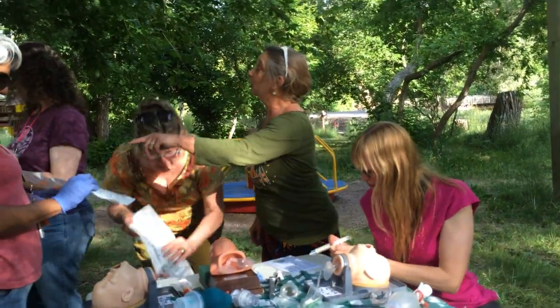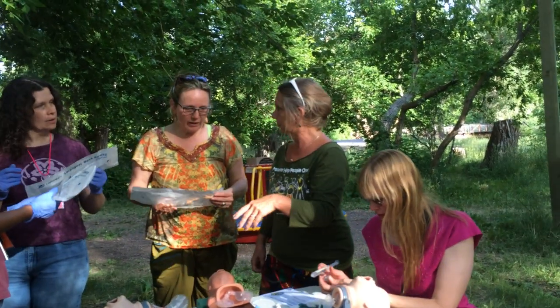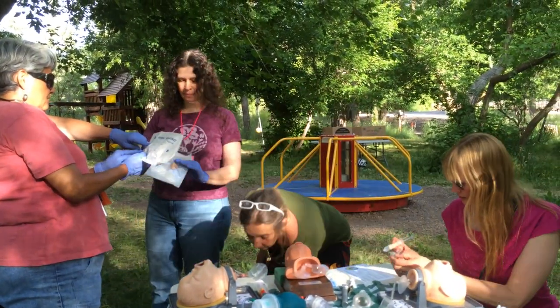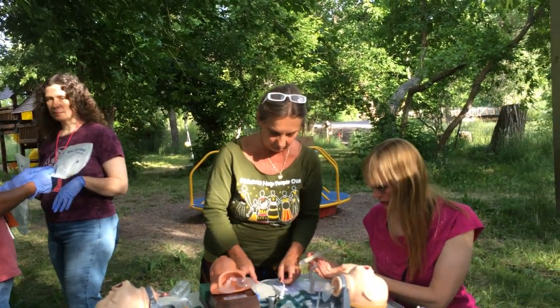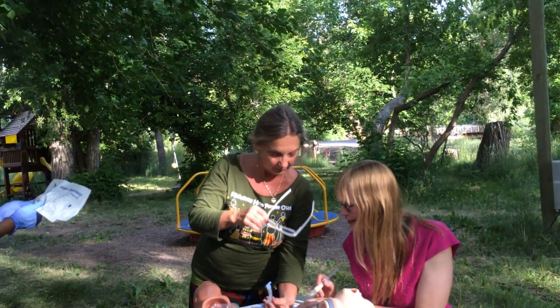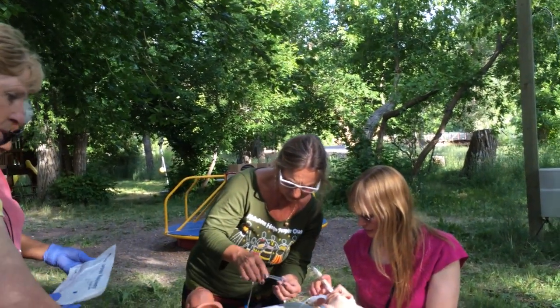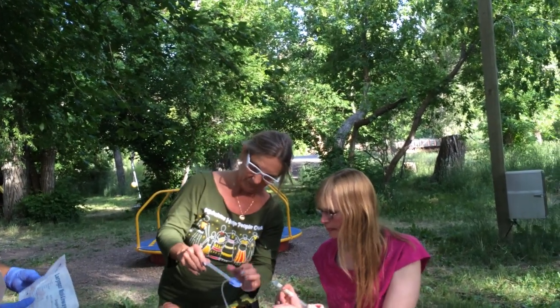Otherwise, you're transporting. There's no way you're going to extubate and keep a kid at home that you had to go so far as to put it in. If the baby has come around enough, it will work it out. Just continue the transport, transfer care, and let them figure out why you had to get that part down the road. It could be something else going on, and then the baby's going to tank again. Now you've extubated the baby. Yeah, leave it in. This is transfer care. Let them take it out, or they'll put an ET tube in.